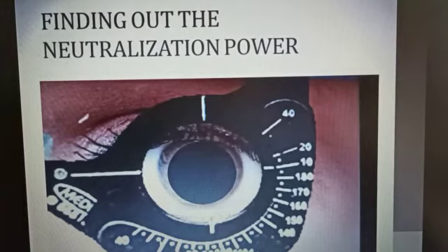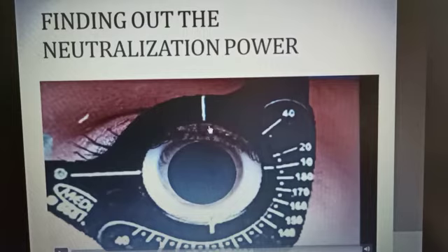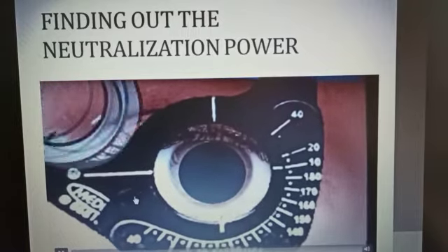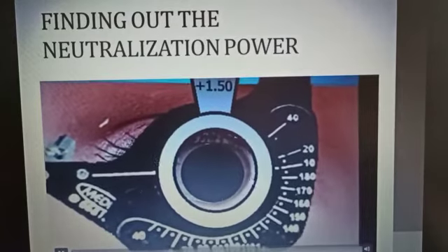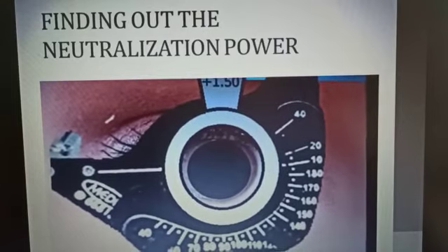In this video, I will show you one example of how to do a retinoscopy if the patient is having a spherocylinder power. You can see the patient is wearing a trial frame. For retinoscopy, you have to neutralize one meridian first, then proceed to the other meridian. Here, we will neutralize the vertical meridian first, then we will neutralize the horizontal meridian. We have placed the working distance — here we have been using plus 1.5, which means we are doing the retinoscopy at a distance of 66 centimetres.